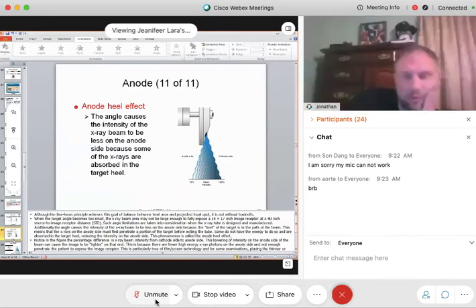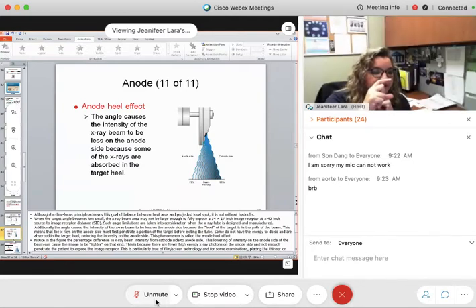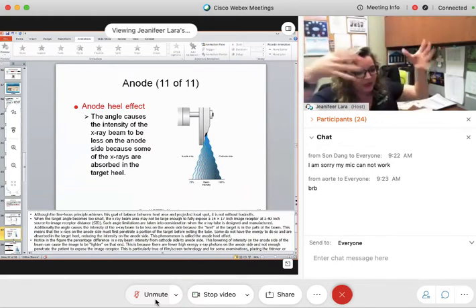So is it safe to say that with the larger actual focal spot, you get more electrons hitting it, so you get more X-rays produced while also having more area to spread the heat out? Yes, absolutely. That is absolutely correct. Because if we can utilize the entire width of the tungsten target, that's best, so that we can get all those conversions. And if there are any conversions of X-rays outside of the target, they won't ever make their way into the effective focal spot. That is going to be leakage radiation. Make sense? Good. We want less leakage and more effective.